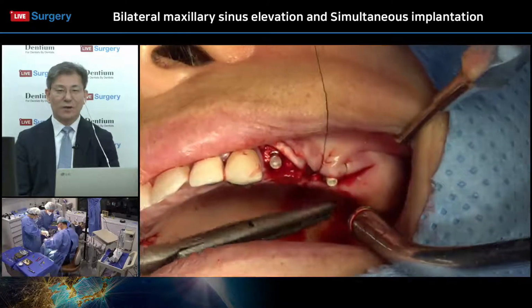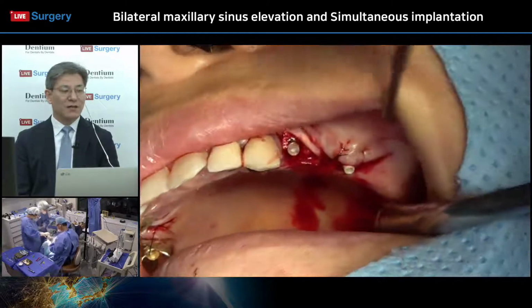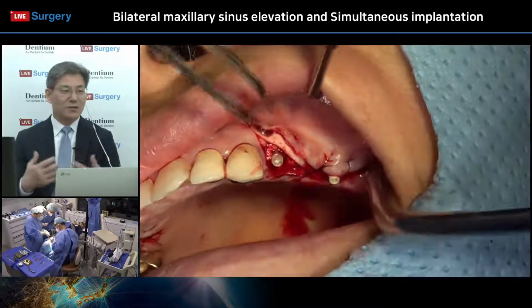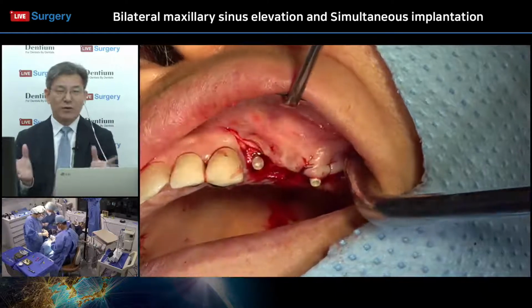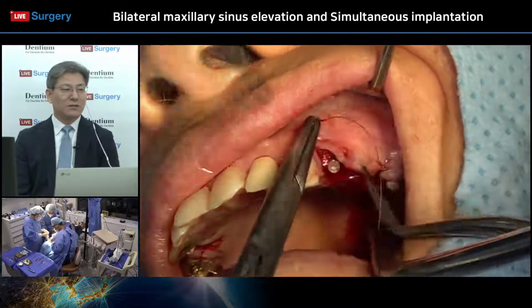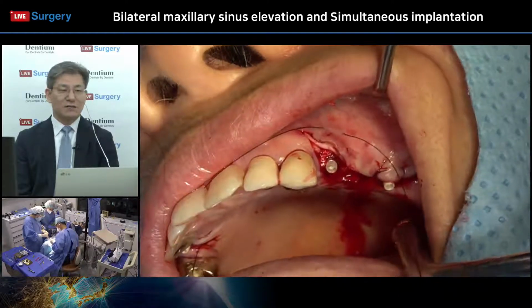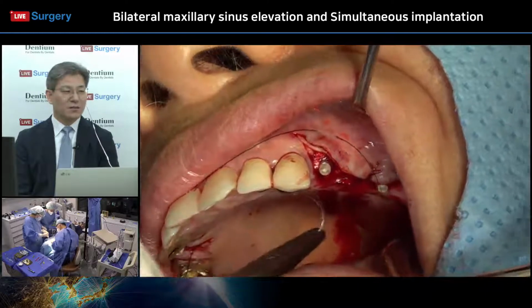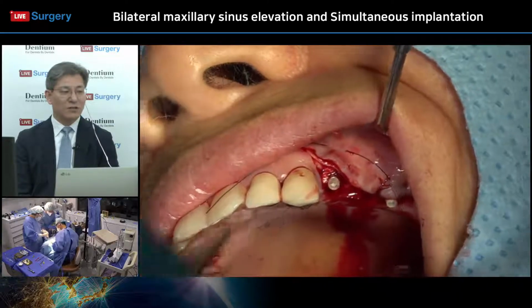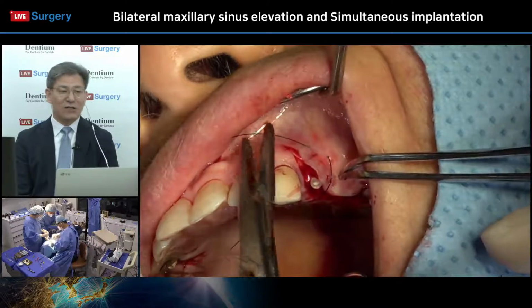A sharp scalpel sometimes makes a perforation of the overlying flap, which can make a very difficult situation, blocking the blood supply, so sometimes the flap opens or there is some necrosis of the overlying flap. So cautious usage is always necessary with the scalpel. Instead of the scalpel, this kind of periodontal curette is very useful and a good instrumentation procedure. So we have to learn every time from this kind of live surgery.